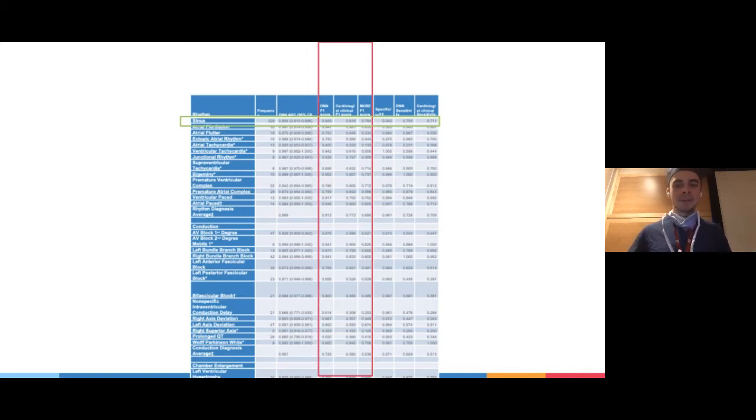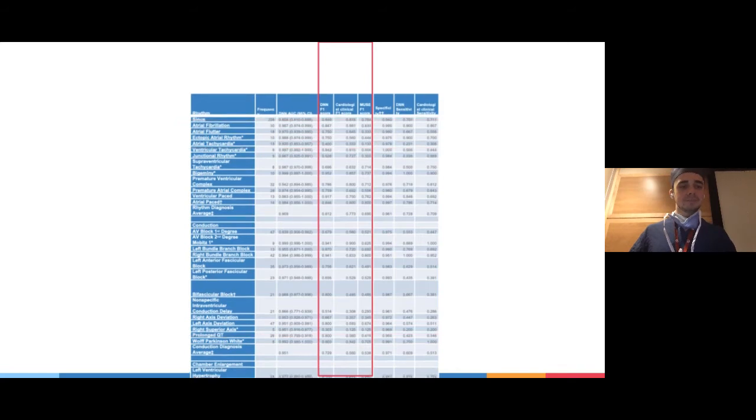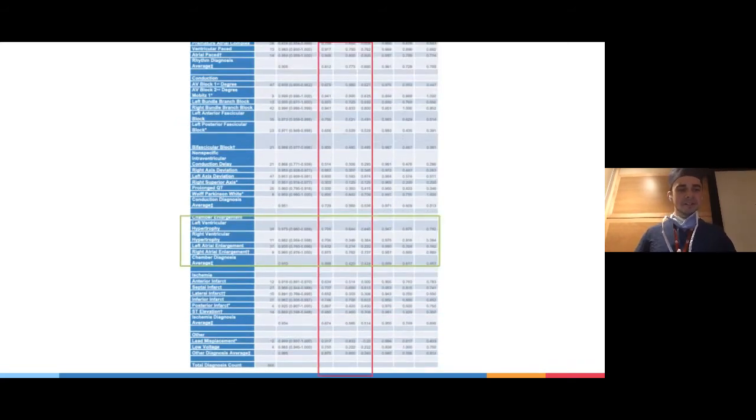So sinus rhythm, ventricular tachycardia, non-specific intraventricular conduction delay, and prolonged QT were all diagnostic classes where AI outperformed the cardiologist. And when we look in red, classes where AI underperformed the cardiologist, you have here AFib, junctional rhythm, and also Wolf-Parkinson-White. Also, when we scroll down in the table, you can look for chamber enlargement and overall the F1 score, which is like a surrogate for the AUC curve, is higher again for the AI algorithm, which is this column. And then you also have ischemia.